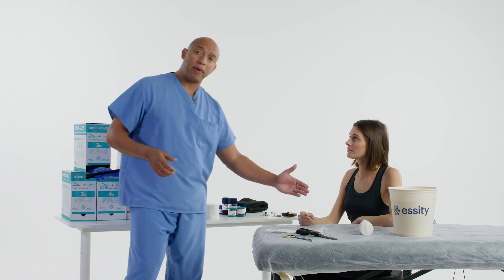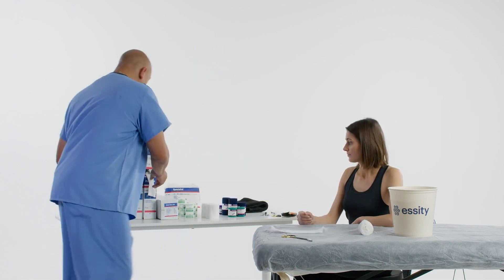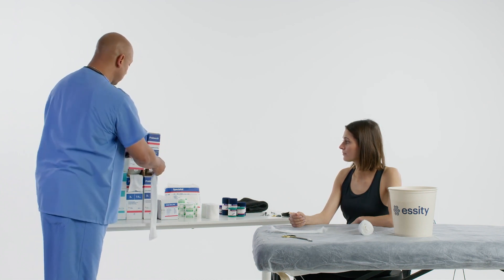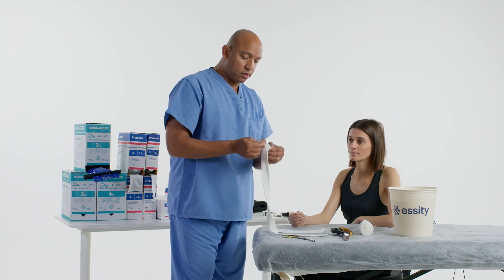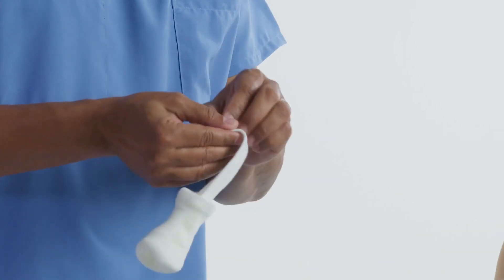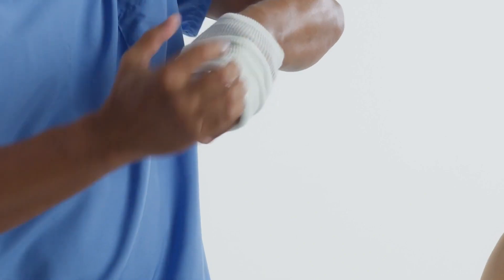I'll get the uninjured extremity and measure from the tip of the thumb all the way to how far proximal I want the splint to go. Just a hair past it so that their thumb is not exposed, so they won't bump it on something and cause further harm. So this is my template of how far distal and how far proximal. Put that aside. Let's get some stockinette and apply it on the patient's extremity. That just keeps everything enveloped extra neat, and sometimes patients feel irritated from any type of padding applied on the extremity.